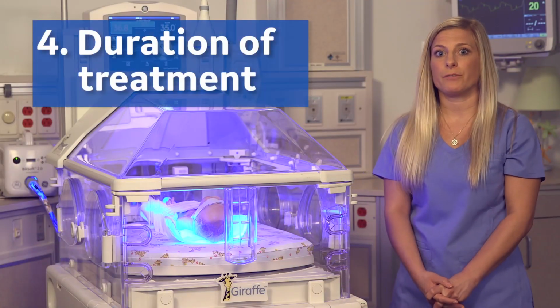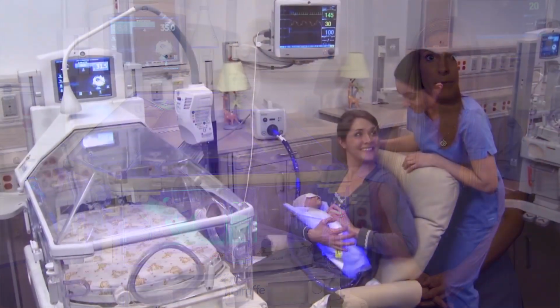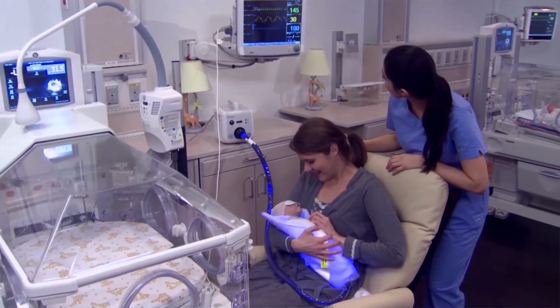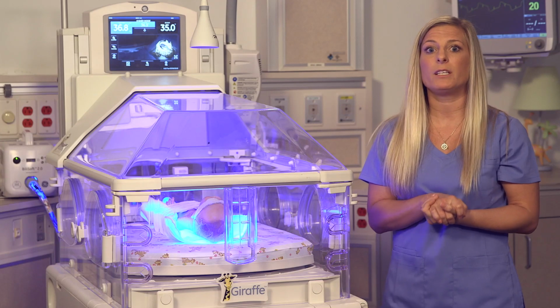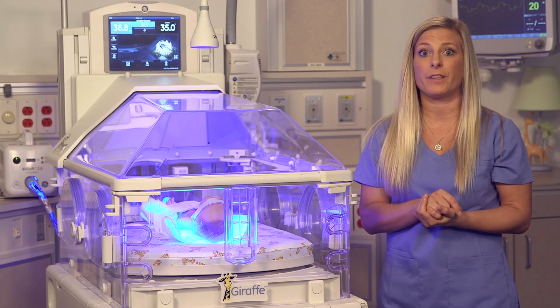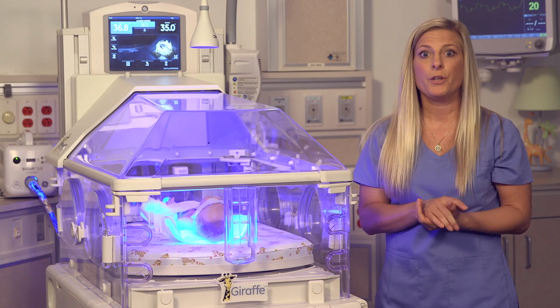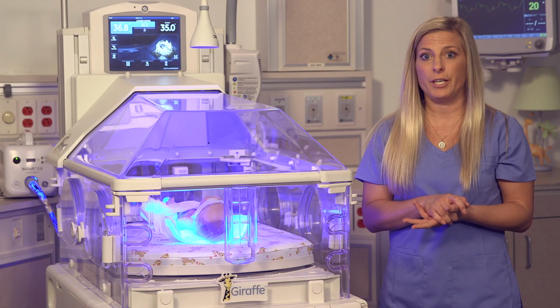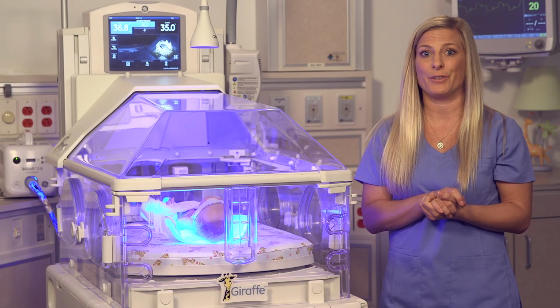So let's talk about duration of phototherapy exposure. Generally, you don't need to interrupt phototherapy for clinical care or family bonding. And what most people don't realize about phototherapy is that you need to check the dose of your phototherapy device utilizing the meter designed for that specific medical device, validated for use by the manufacturer. So for example, if you have a GE phototherapy device, always use the BiliBlanket Meter 2, or if GE should adopt a new meter in the future, it would be validated for use with our devices.